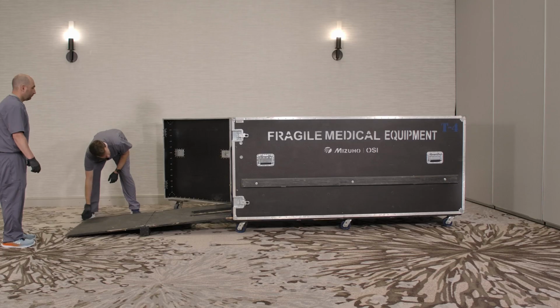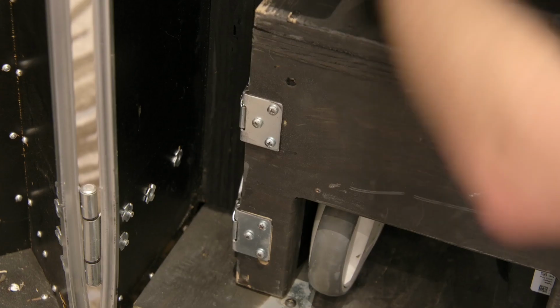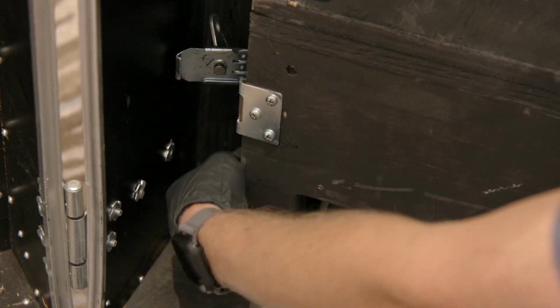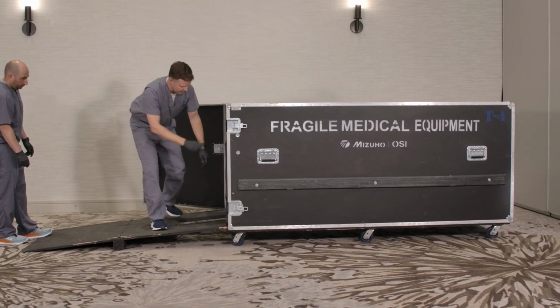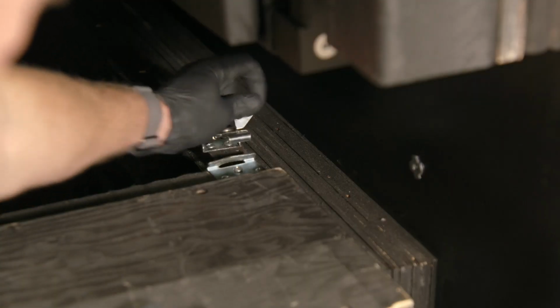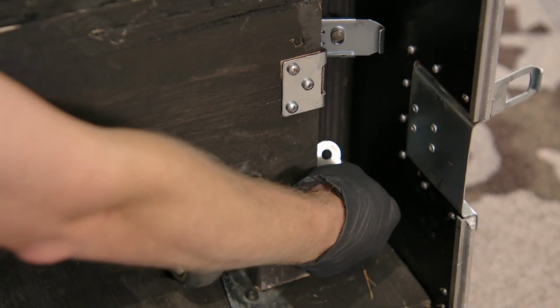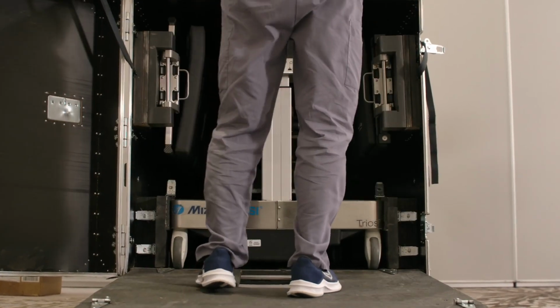At the bottom of the crate, unclip the top and bottom latches on both the right side and left side of the table block. There will be two top latches, left and right, and four front latches left and right that secure the table block in place. Repeat on the opposite side of the crate. Once the clips are undone, remove the table block and set it on top of the crate so it will be out of the way.